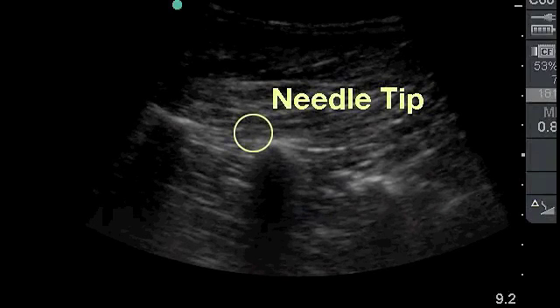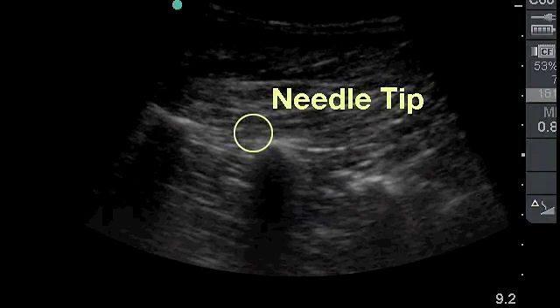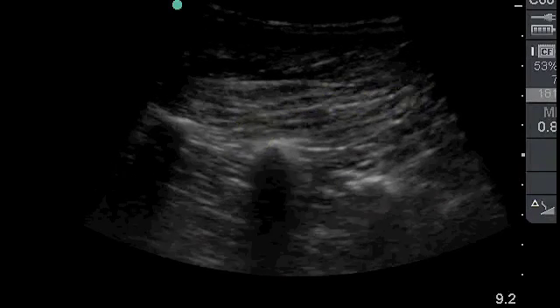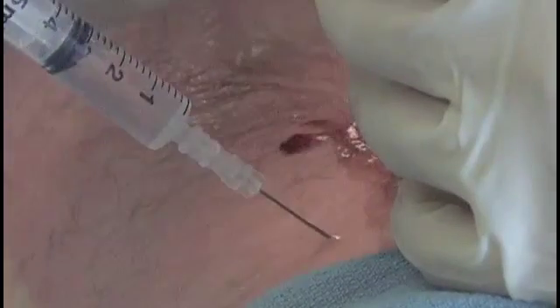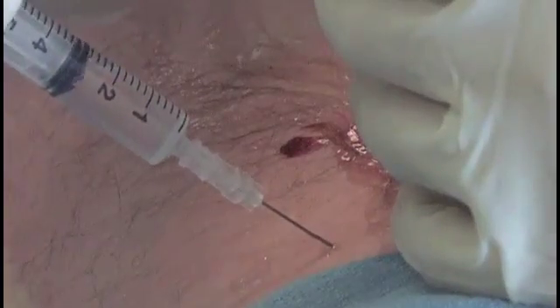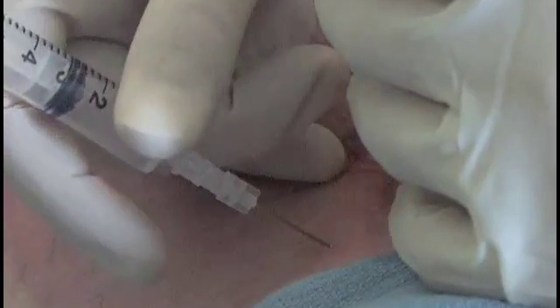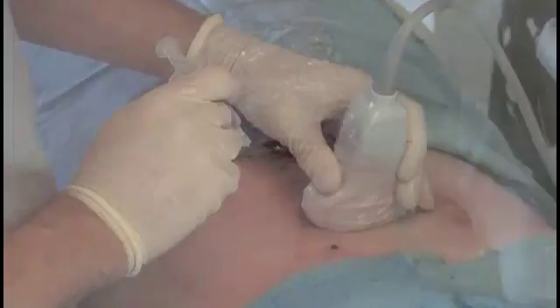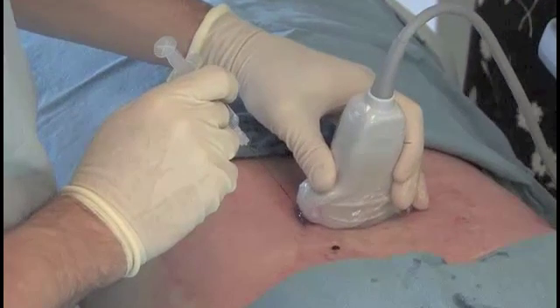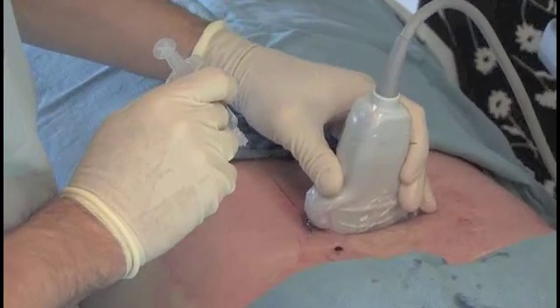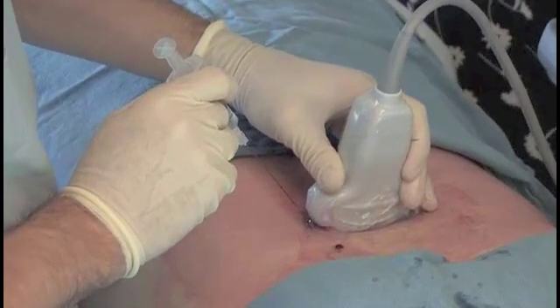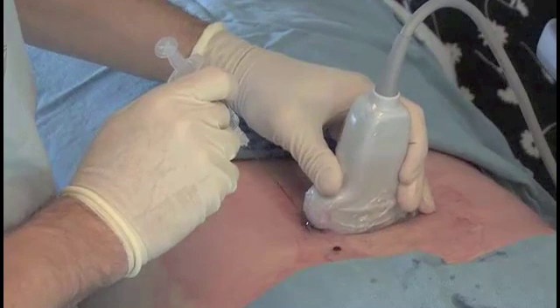If the needle tip is seen caudally, gently reposition it cephalad. 0.5 milliliters of 0.5 percent bupivacaine is injected into each point. Injection of the nerve at the corresponding spinal level and one level above is needed to anesthetize the cephalad joint.